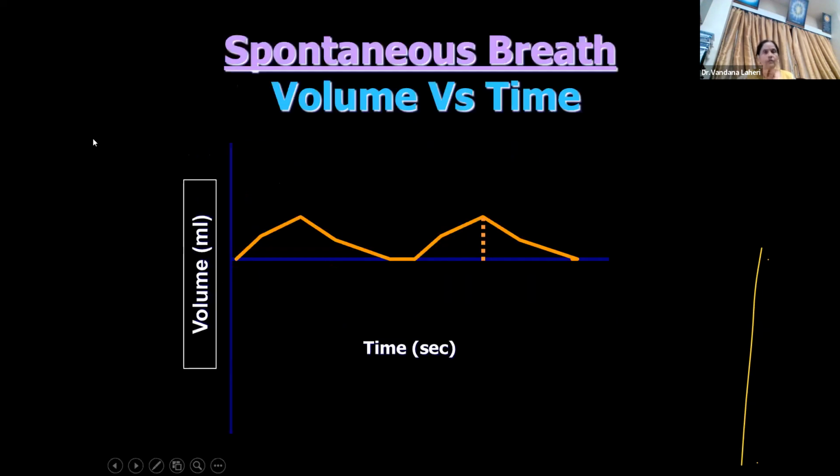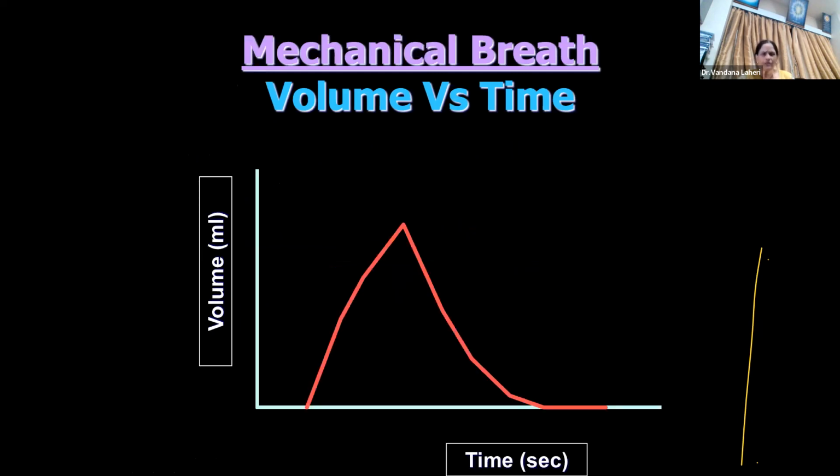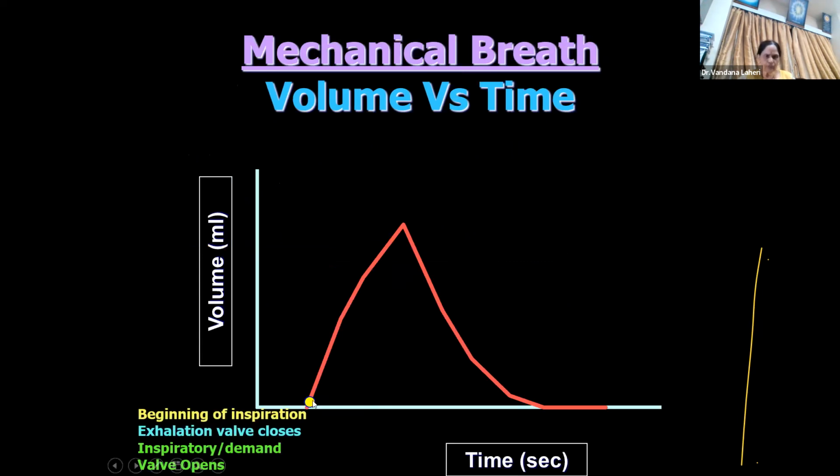Now let us go to volume versus time. This is inspiration. This is expiration. There is not much to be seen in the volume versus time graphic. This is the beginning of inspiration, so the exhalation valve closes, the inspiratory or the demand valve opens. The flow begins, and that is why the pressure rises.